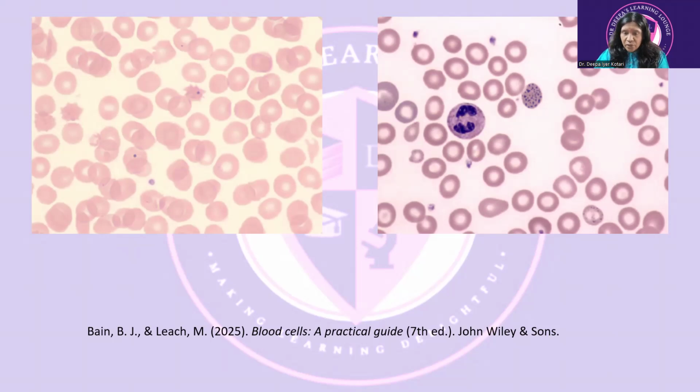On the right, what you're able to see is a blood film of lead poisoning, and you're able to see some polychromatophils here. That's a neutrophil, and this is basophilic stippling. There are coarse granules all over the RBC, unlike just a single dot in the Howell-Jolly body. So this is something you should be aware of.